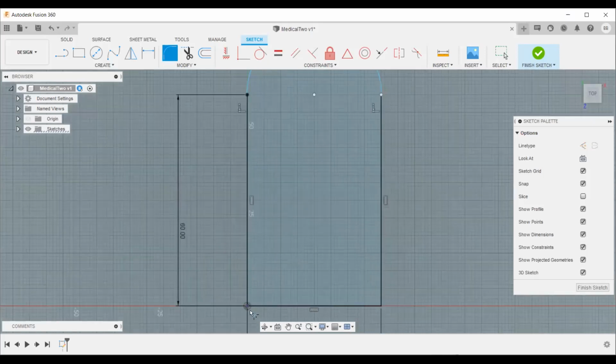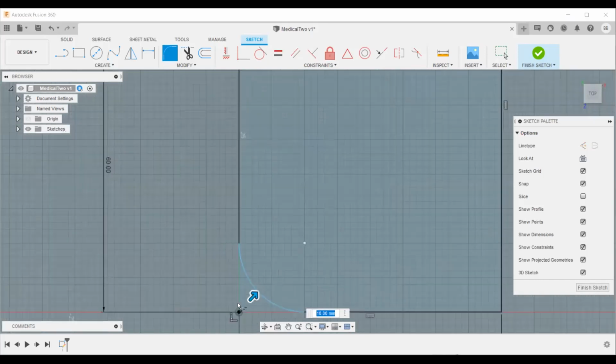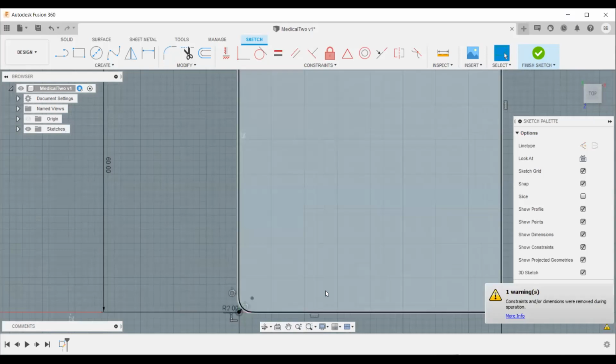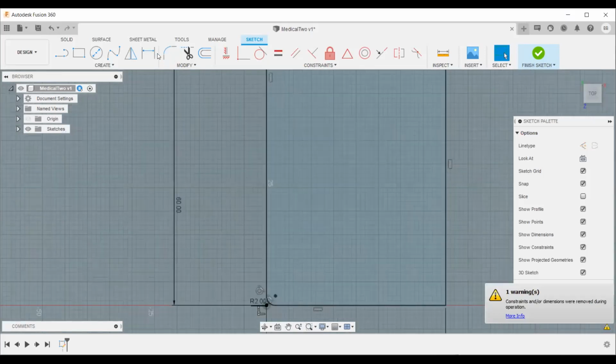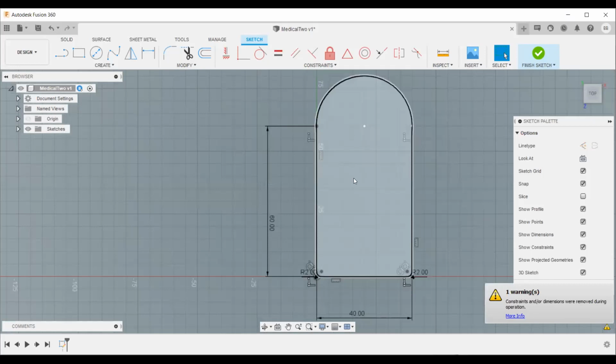Then down here, those who are filleting, I told you how to fillet. Use 2. So fillet the bottom parts, 2. Is everyone there?